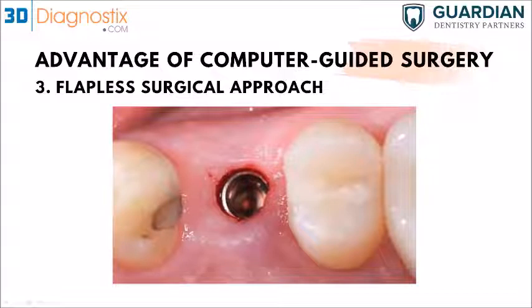So Dr. Hassan, what do you think? Well, usually what we recommend is, as long as we've got the metal sleeve in the surgical guide above the tissue, then they can simply place the guide on top of the teeth and remove that tissue with a punch. And of course, you can have that done guided through the sleeve. So it's as simple as placing the tissue punch inside, cutting the tissue and taking it out.